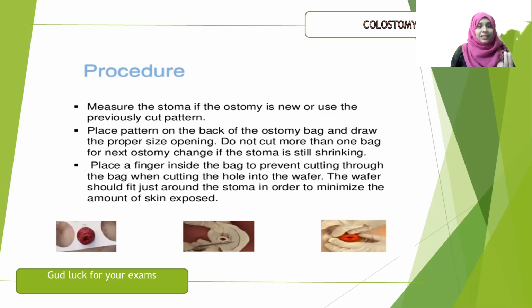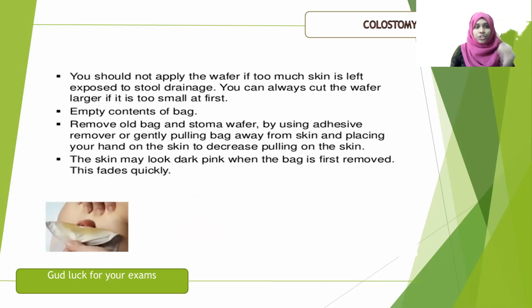When cutting the hole into the wafer, fit it just around the stoma in order to minimize skin exposure to the stool. You should not leave too much of the skin exposed to the stool, as we said before. Make sure the skin has less exposure to the stool. Empty the contents of the bag.